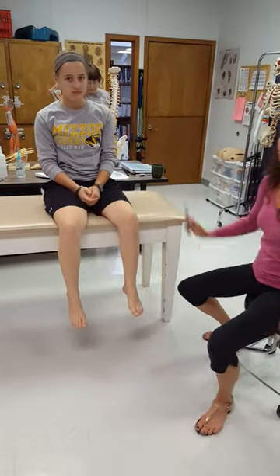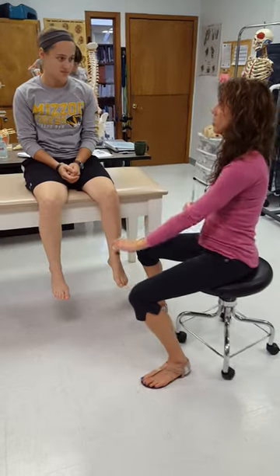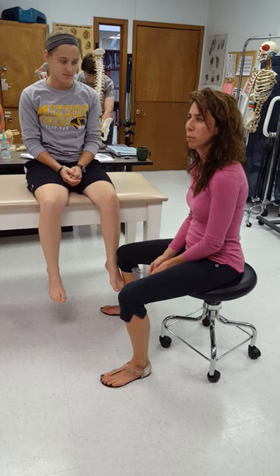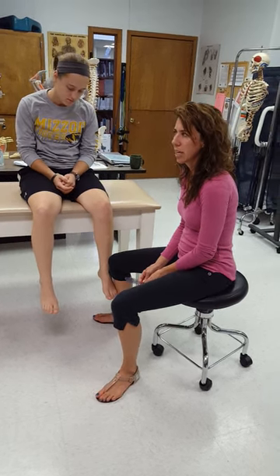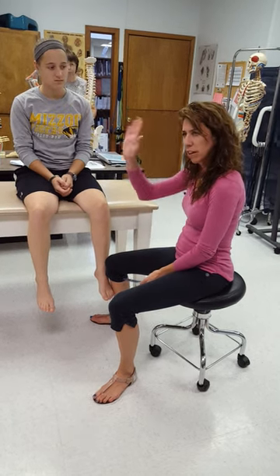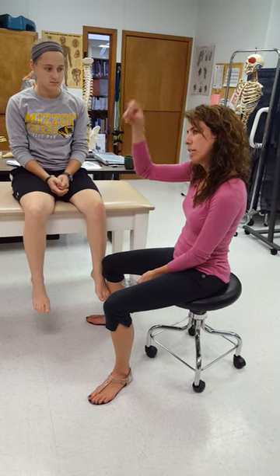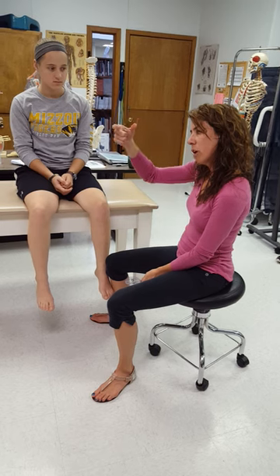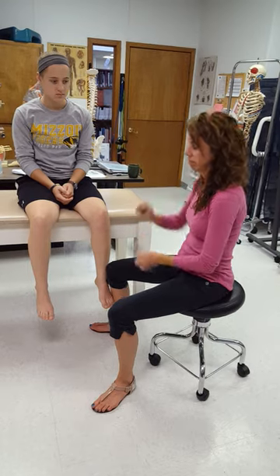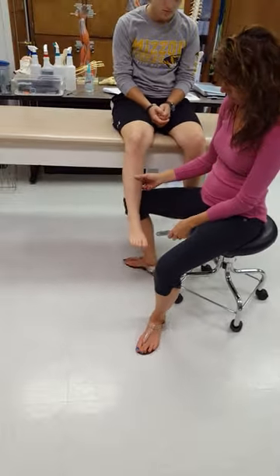We're doing ankle inversion and eversion. That is a movement between the calcaneus and the talus. Dorsiflexion and plantar flexion happens between the tib-fib bones and the talus, and below that is the talus articulating with the calcaneus — that's the inversion/eversion motion.